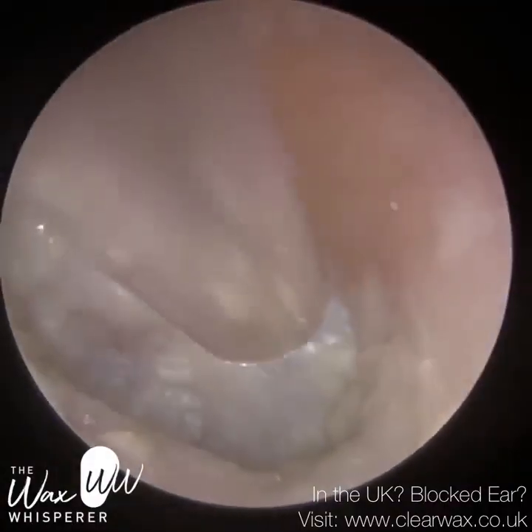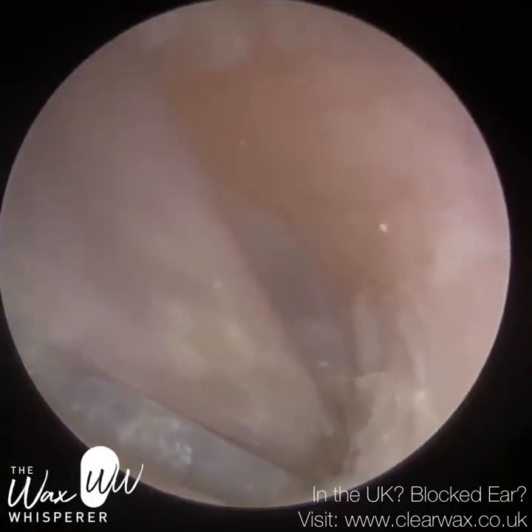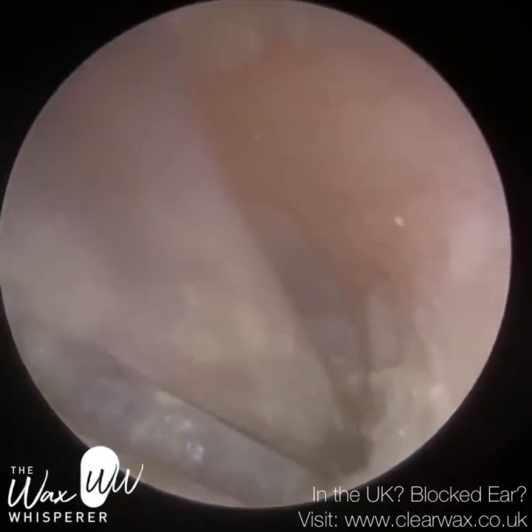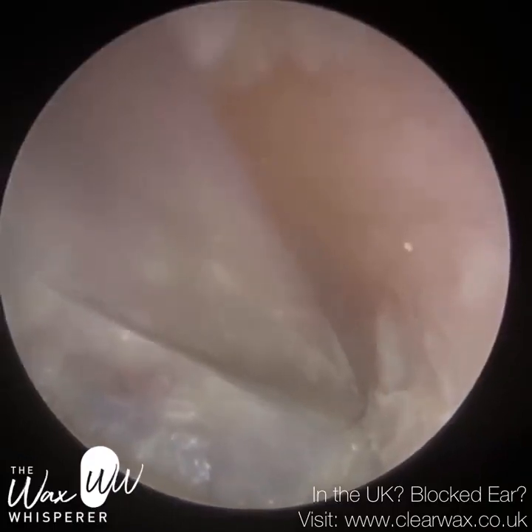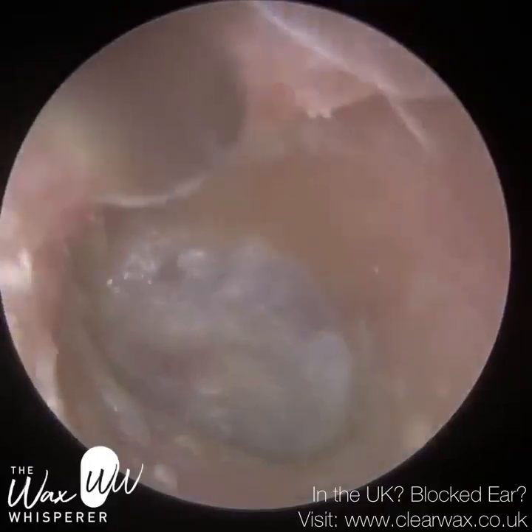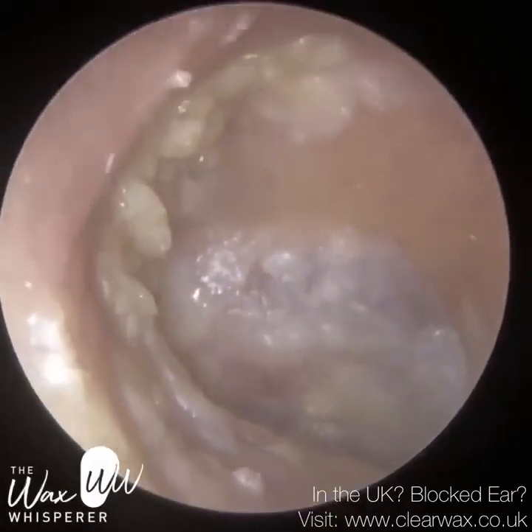So it is quite a tedious procedure. We're just trying to remove as much debris as we can. A lot of this, as I said, the consistency just makes it hard to suction because it's a very thick, dense, mushy consistency, and that can clog up the suction tube, and it's very hard to vacuum it all off because a lot of it still smears and stains the canal wall and the eardrum. So you are still going to see some debris there, but we've removed quite a significant amount already.